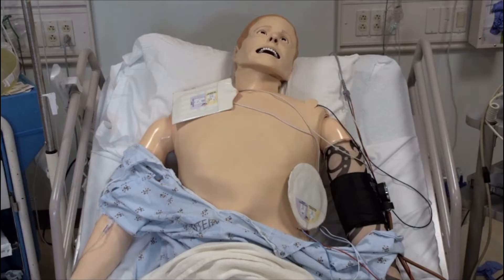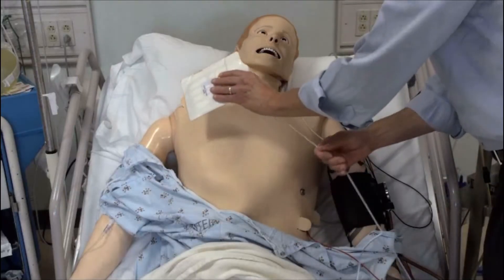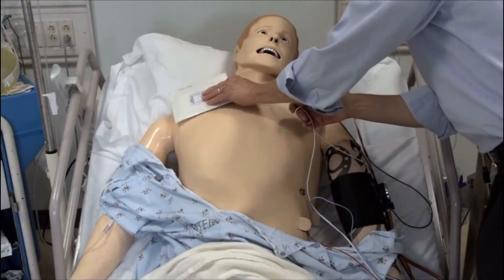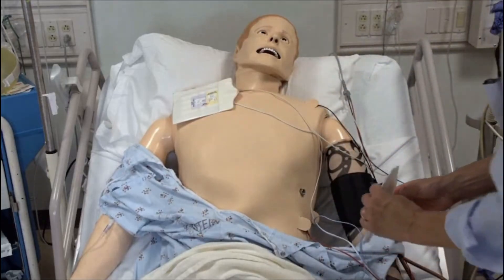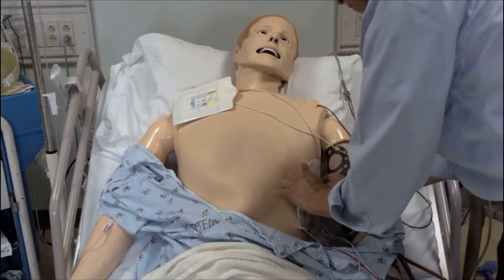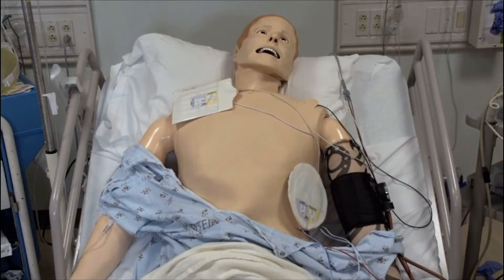You can do synchronized cardioversion using adhesive electrode pads or paddles. You may use anterolateral placement for both pads and paddles. Place the anterior pad just to the right of the sternum below the clavicle at the second or third intercostal space. Place the lateral pad below the left nipple just medial to the anterior axillary line at the fifth or sixth intercostal space.